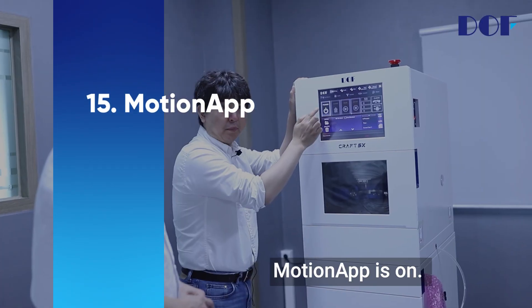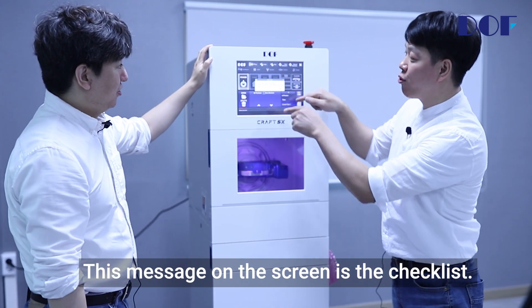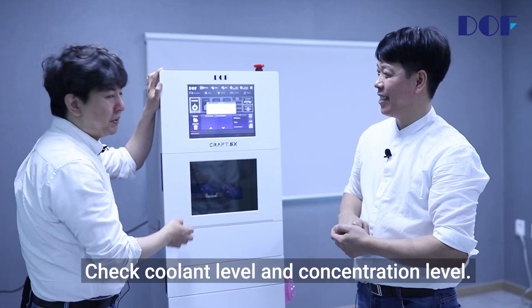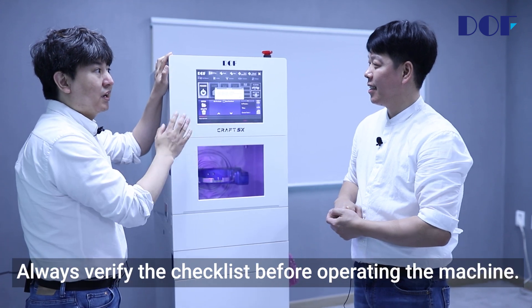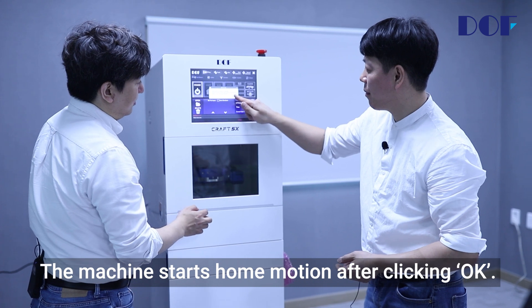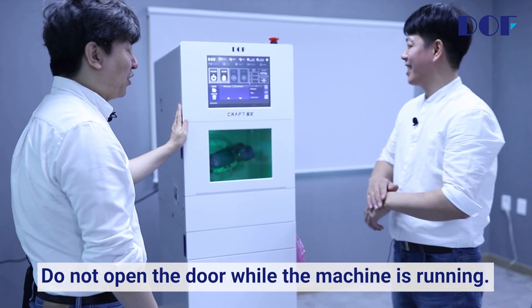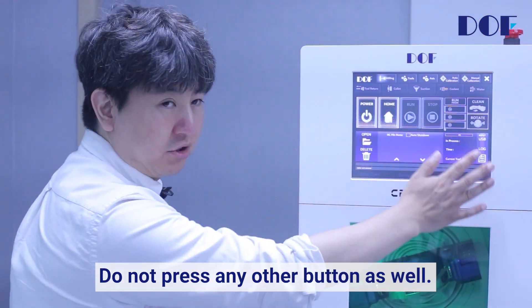Motion app is on. Click the power button to connect the PC and the machine. This message on the screen is the checklist. Check the tool number in the spindle, check coolant level and concentration level, and check chip collector filters. Always verify the checklist before operating the machine. The machine starts home motion after clicking OK. Do not open the door while the machine is running, and do not press any other button.